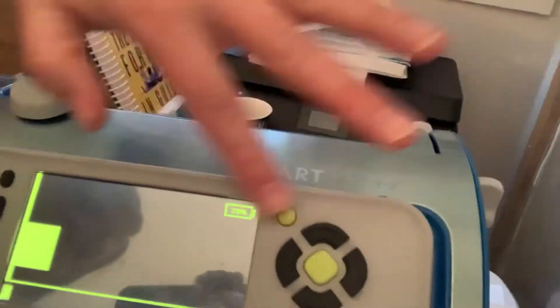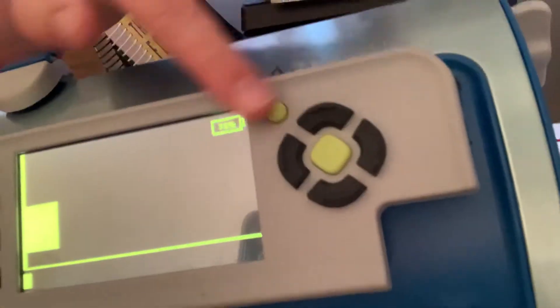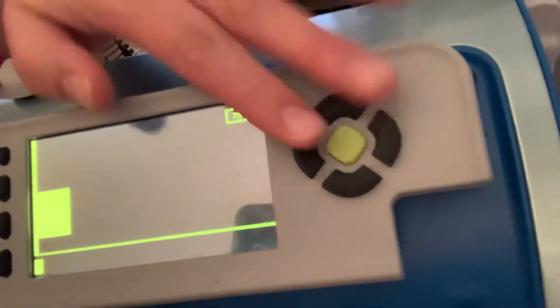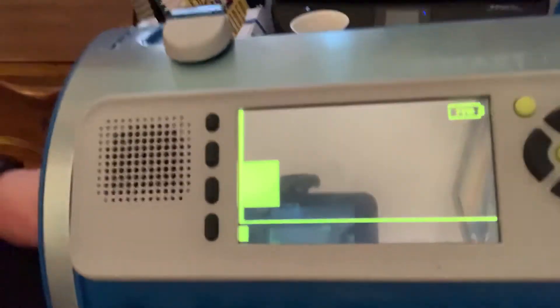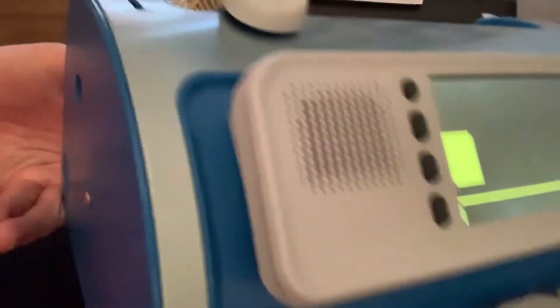This is the menu control button right here. I will go over that in a different video for you, but I just wanted to go through and talk to you about the functions of the brailler.